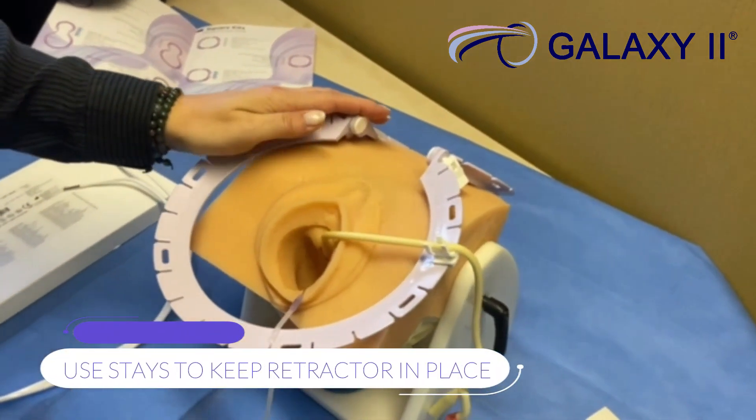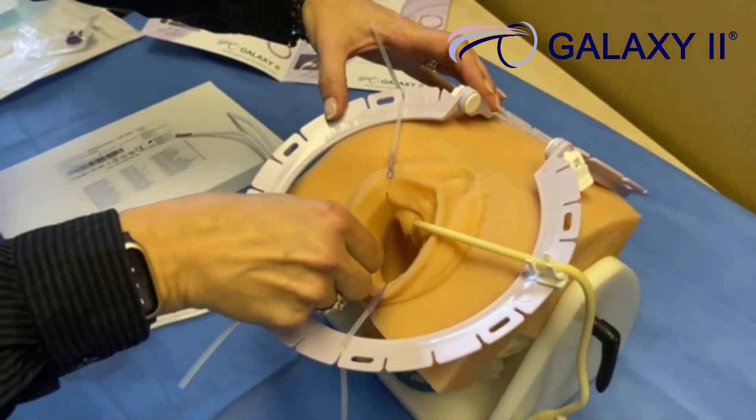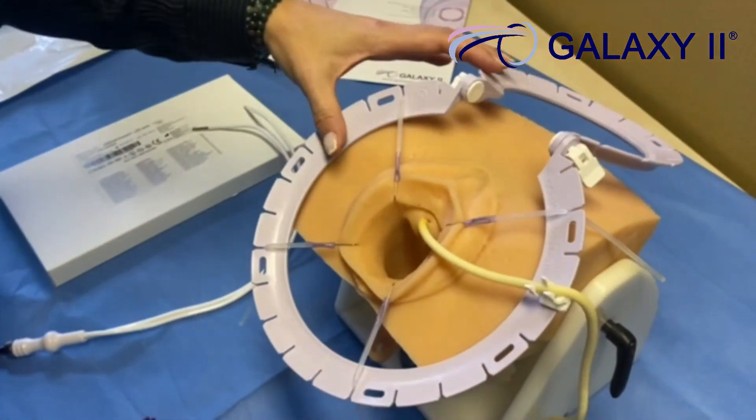Always ensure the retractor is held in place. Please notice the way we attach the stays to ensure this stays in place. You can use as many stays as you feel necessary.